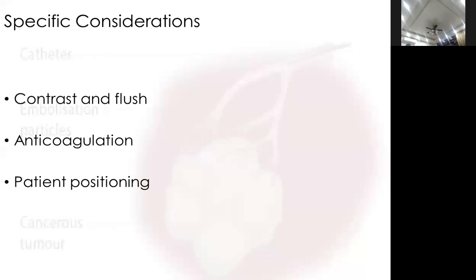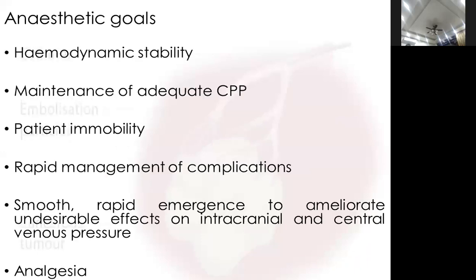And the anticoagulation, of course, because they might use between 70 and 100 international units per kilogram. This sometimes would necessitate, based on the ACT, the activated clotting time, giving protamine to reverse the effect of heparin afterwards. And patient positioning. This is extremely important because you are opposite to the patient. You have limited access to the patient in case a catastrophe would happen. So you should use longer circuits, longer tubing, longer everything in these procedures.